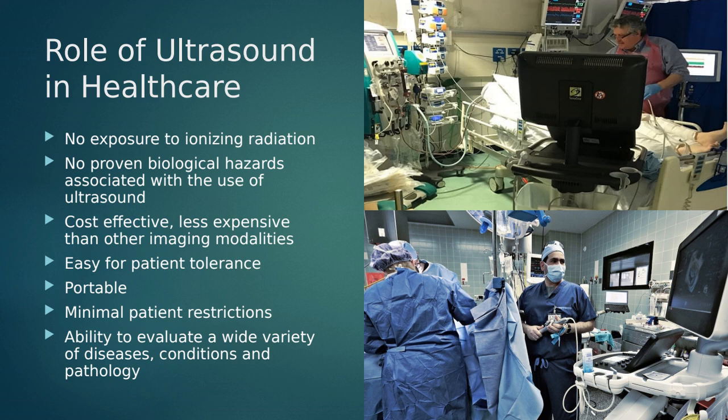It's portable, meaning we can take it anywhere in the hospital. We can take it to nursing homes. We can put the ultrasound machine in our car if we're a travel tech somewhere. And it's easy for us to diagnose conditions in live time. So if we're looking at a vascular condition, we can see what's happening with that vein or with that artery while it's pulsing, while it's occurring. So it's extremely fast, reliable. There's not enough that we can say in terms of good things with ultrasound. It really is becoming more widely accepted.